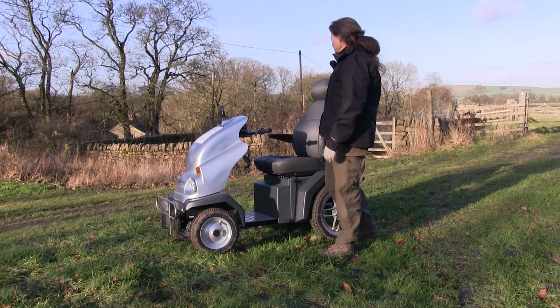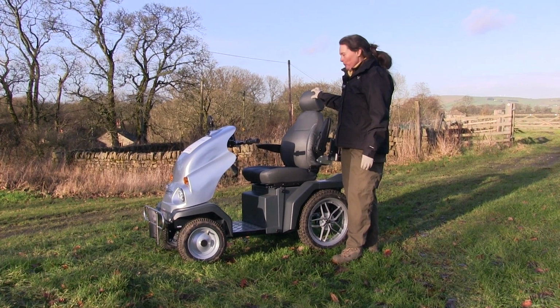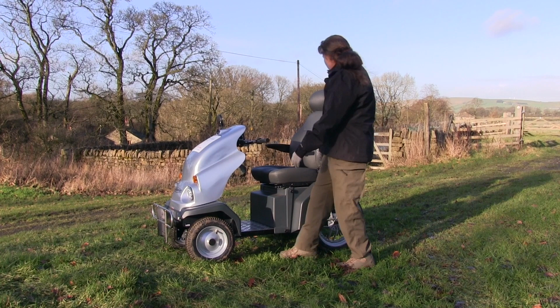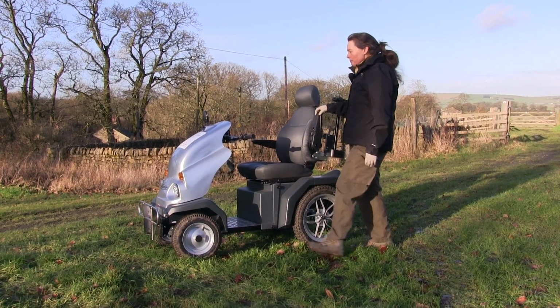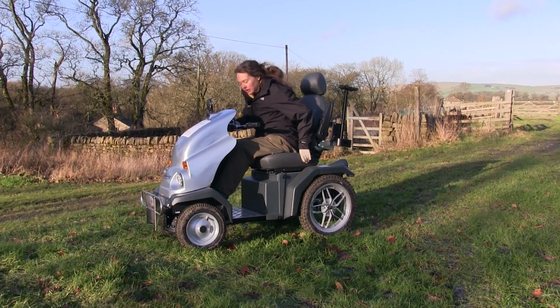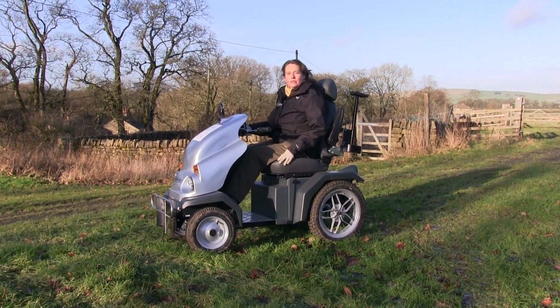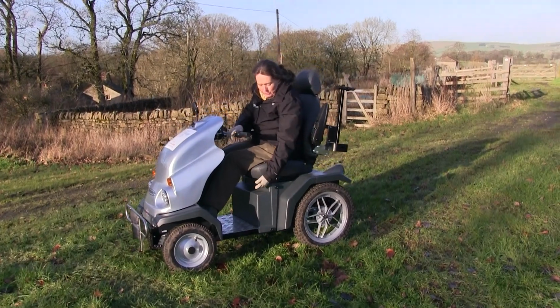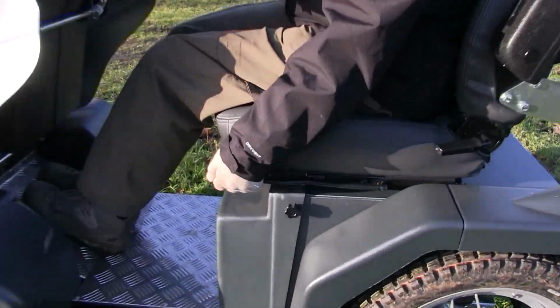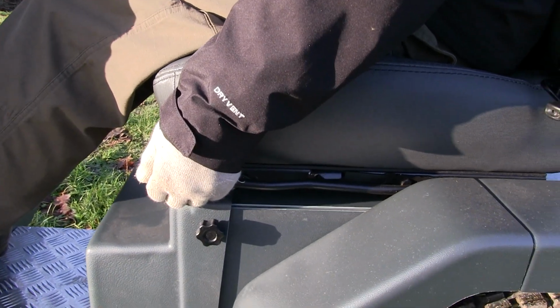So the first thing when you're getting yourself into the Tramper is to make yourself comfortable. As you come to the Tramper, make sure that the armrest is up. You can sit yourself onto the Tramper and get your feet comfortable on the foot plate. If you need to move the seat backwards and forwards, there's a handle here which if you pull upwards, the seat will slide backwards and forwards.